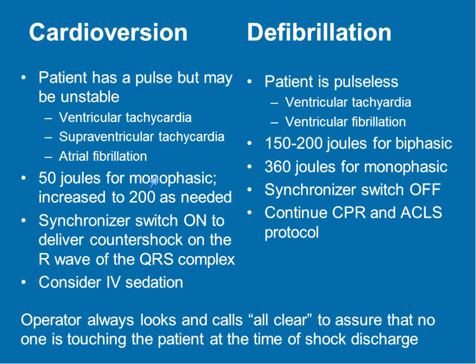The operator of the defibrillator cardioverter is always going to look and call all clear to make sure that no one is touching the patient at the time of shock discharge.